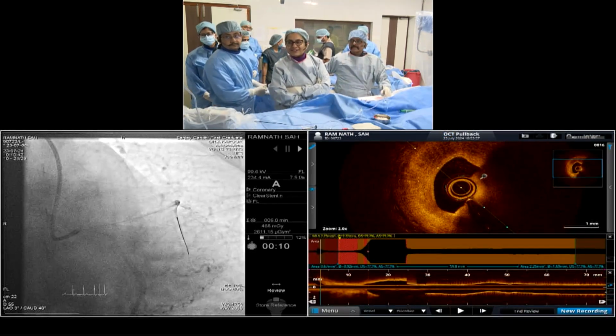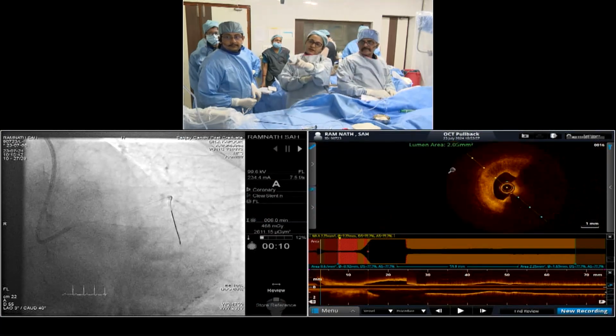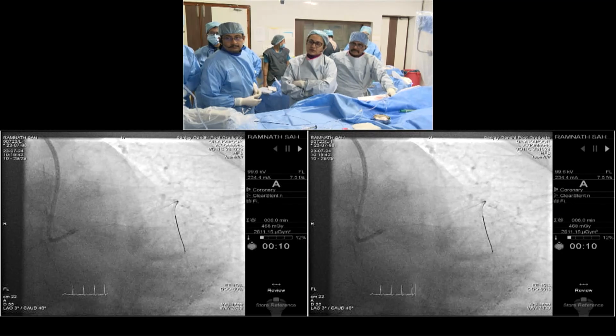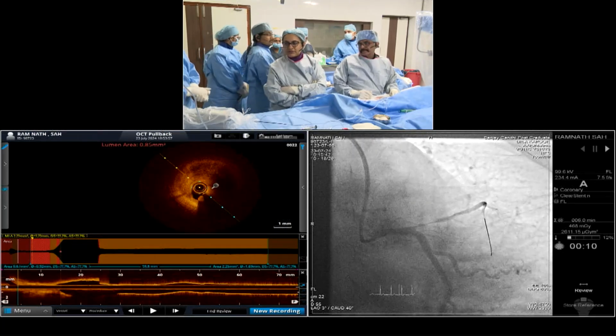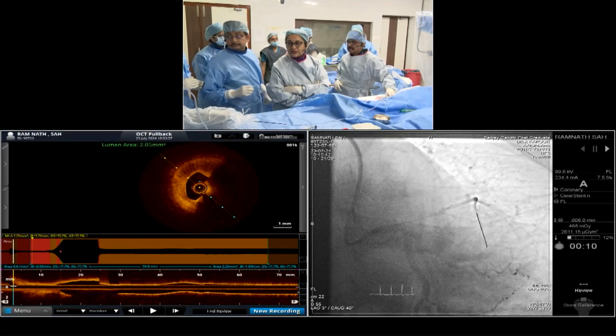2.75 or 2.5? We cannot see the image well. Whatever we are getting is a highly attenuated, hypoattenuated area. We may have a lipidic, high necrotic core, which we expected also, and there is some hyperechoic part, maybe crystals or something, but we cannot be very sure. It is a suboptimal image, so interpretation will be a little difficult.